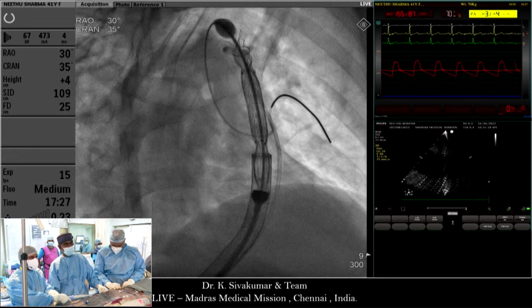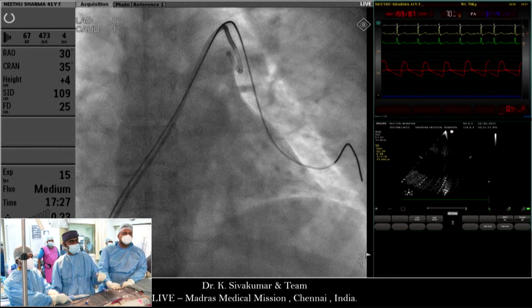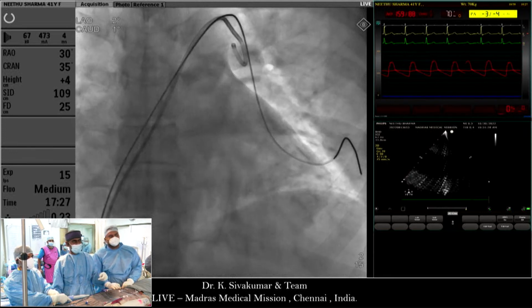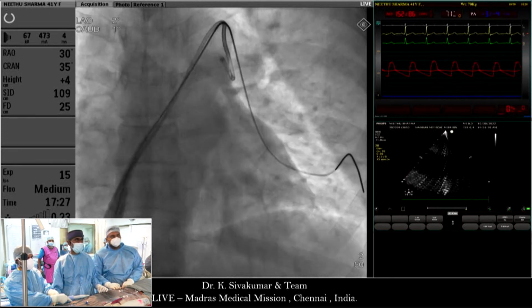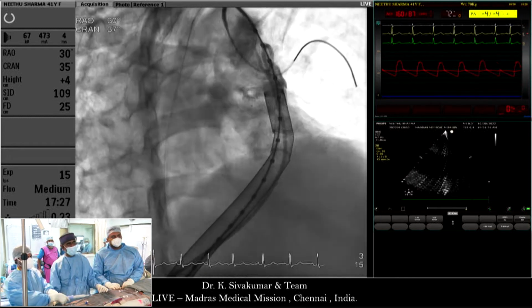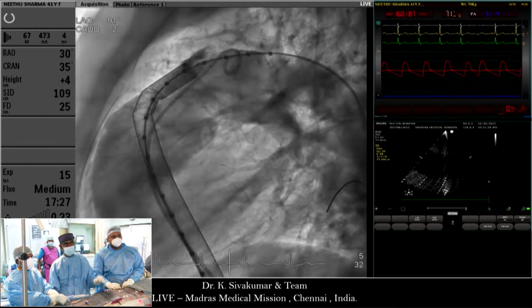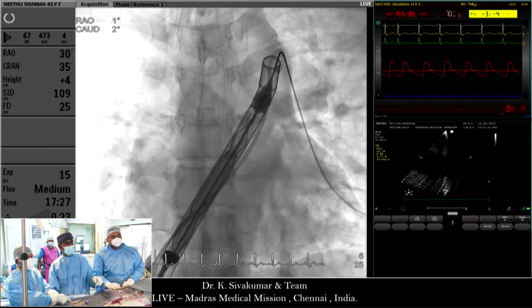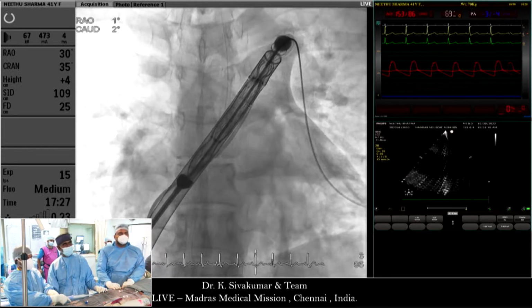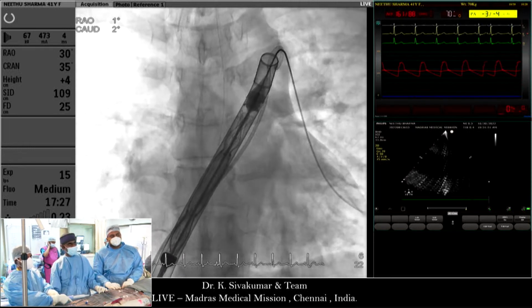Yeah. So please, if you can keep going. I will show you the sheath crossing. Show the previous picture. No, don't go so much. Show the kink in the sheath when we crossed. Yeah, next picture. This is the sheath going part. Next picture. Yeah, show the valve, how it is manipulating the kink. So here you can see that with a little bit of push we were able to get the sheath across the kink. So I would rather say the kink was not hurting us a lot.